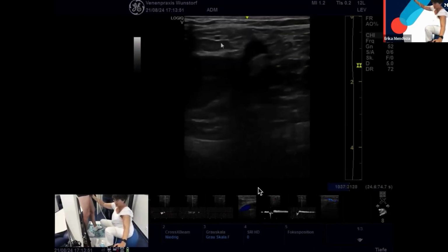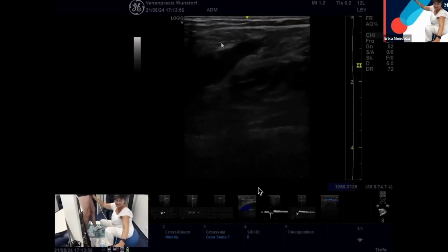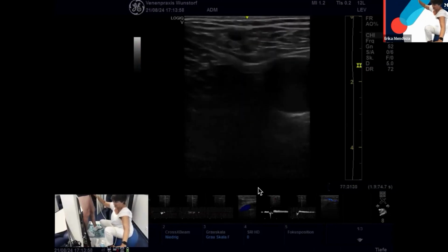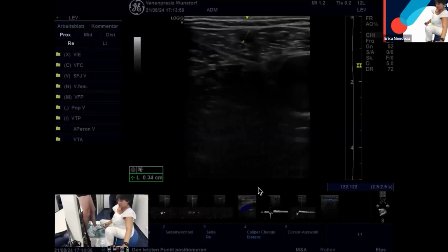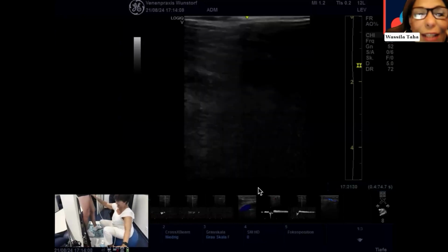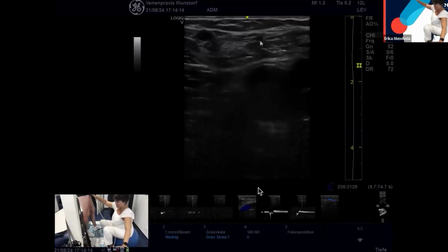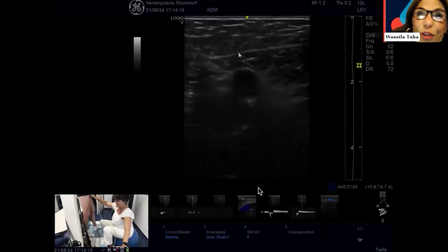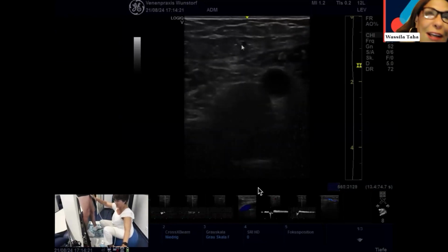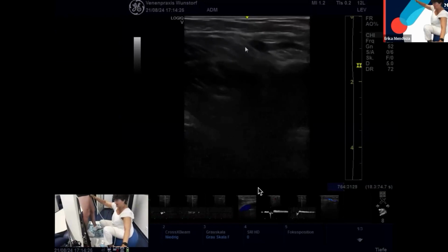And what did you see? Everybody of you is so trained. You say the vein is very tiny. Coming back to Vasilas asking from minutes before, this could be an accessory saphenous vein. This is the anterior saphenous vein. There is no accessory by the recent publication. Professor Alberto Caggiati and colleagues now eliminate the word accessory. It's the anterior saphenous vein.